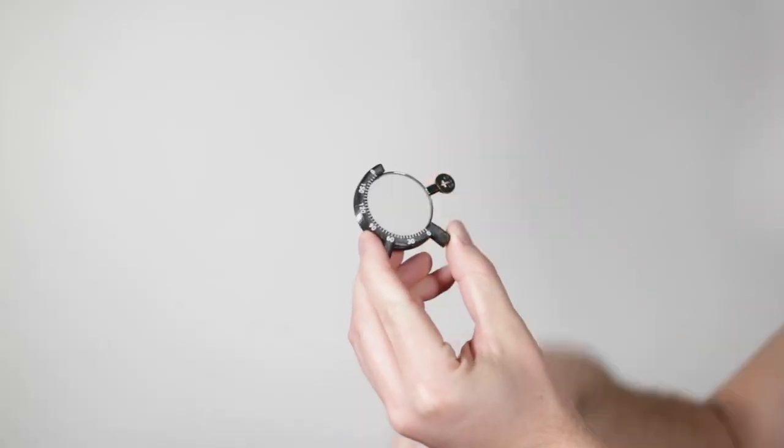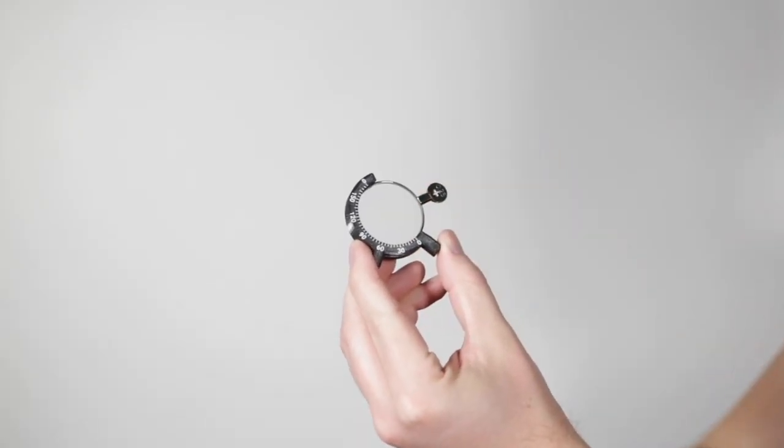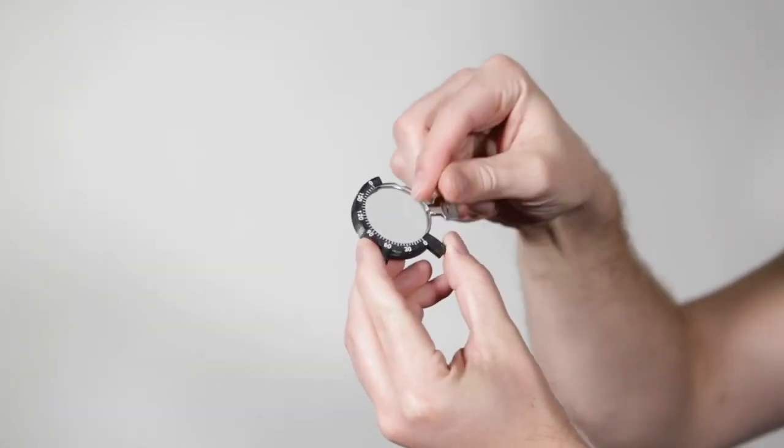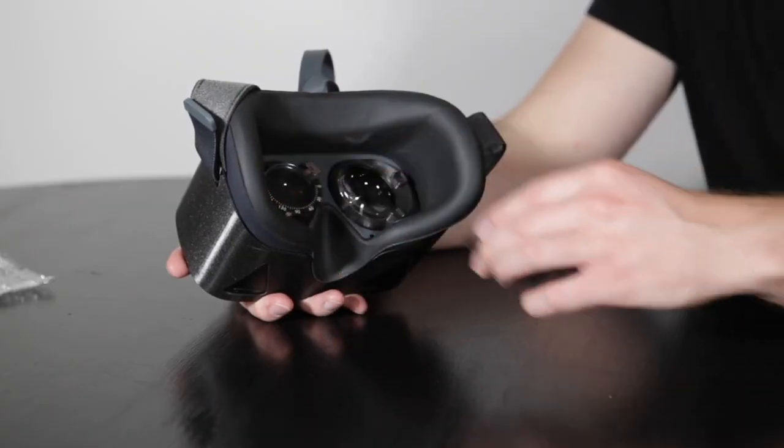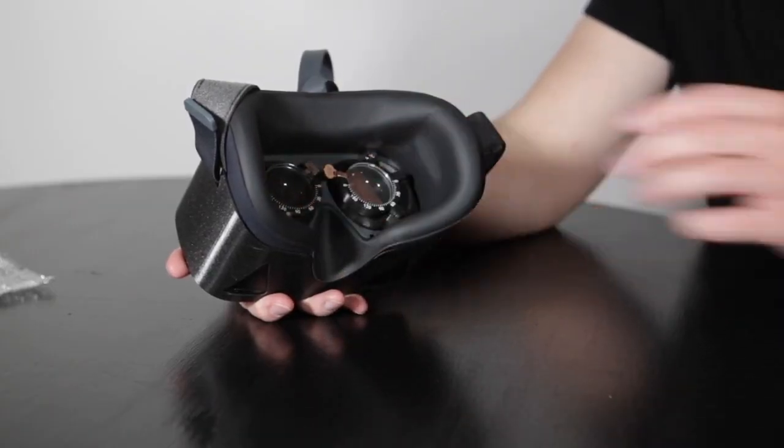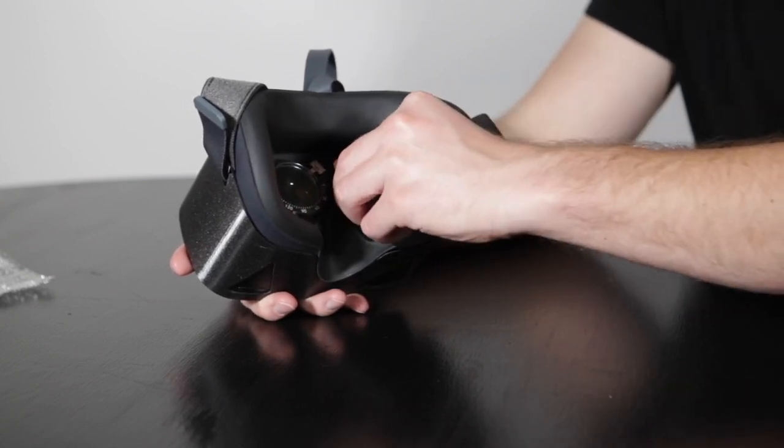Each adapter can hold two lenses — one sphere and one cylinder. The adapters are magnetic. Simply snap them into the headset to begin testing. Ensure that the adapters are securely in the headset or fully removed before testing a patient.